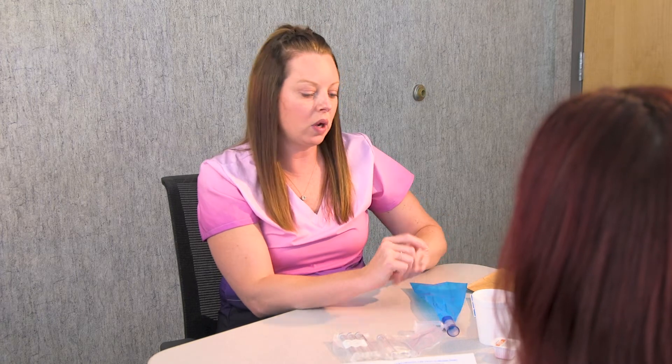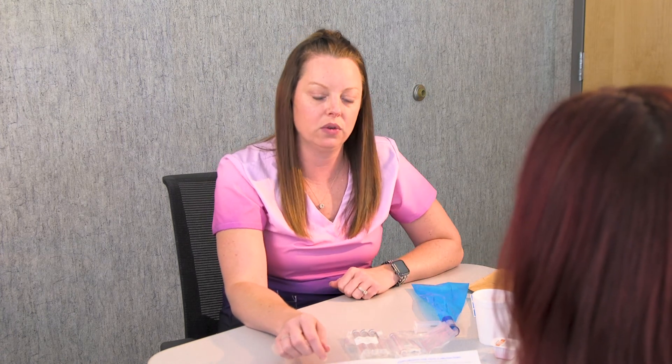If you have the fructose or the lactose test, which are done similarly, the timing is just a little different — it's going to be an hour in between each tube. The instructions are in your test kit, so just go ahead and follow those.